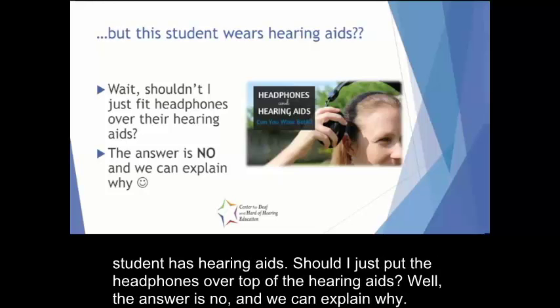But wait, this student has hearing aids. Should I just put the headphones over top of the hearing aids? Well, the answer is no, and we can explain why.